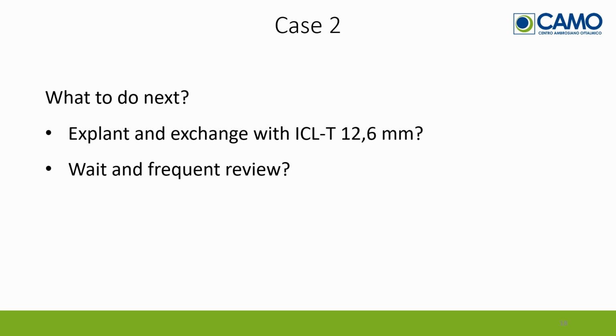We have the option of explanting and changing the lens with a 12.6 millimeter lens, or the option to wait and review the patient in order to monitor for possible movements of the lens or early onset of cataract. In this case, we decided to wait and review the patient carefully. We informed the patient that the lens had a position that was lower than expected, but overall we felt that it was safe to review this patient without further immediate intervention.